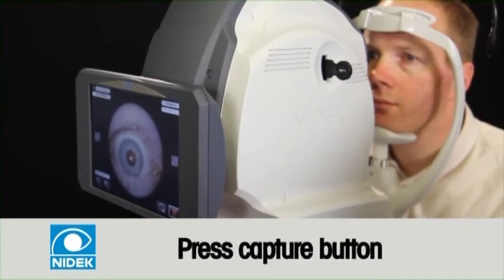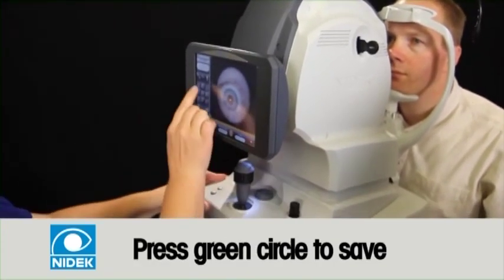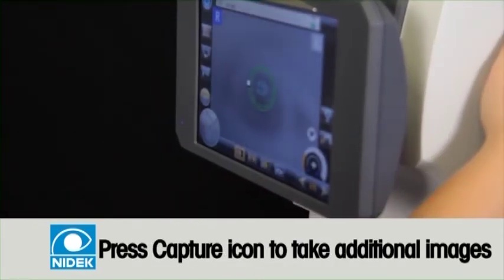Press the capture button to take image. Press the green circle to save image, or press the red X to delete and retake image. If the image is saved, press the capture button to return to the main screen.